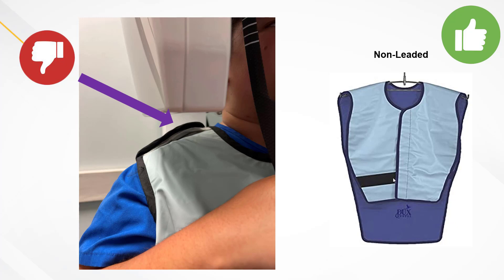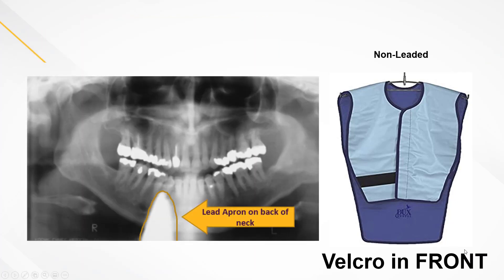The Velcro goes in the front of the patient, not the back — the front crosses over like so. I see way too often that offices have this on backwards. Not the end of the world from a radiation perspective, although there is more scatter radiation coming from the back of the patient, which is why the larger piece is worn in the back. But almost more importantly, if it's on backwards, you're more apt to have an error where the apron is crossed over in the back and a large piece hikes up at the back of the patient's head. So the Velcro will always be crossed over in the front of the patient.